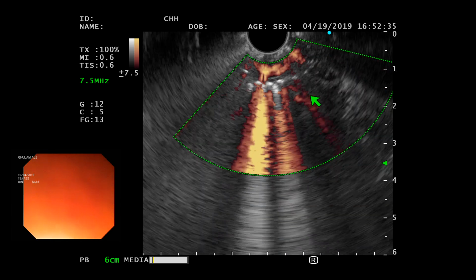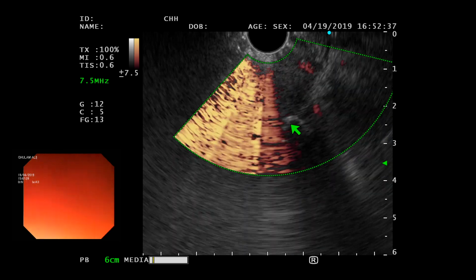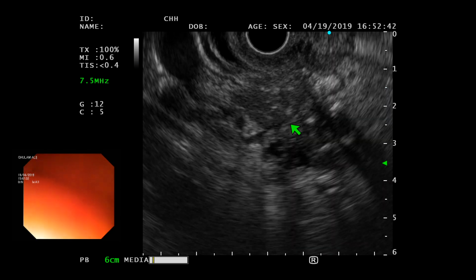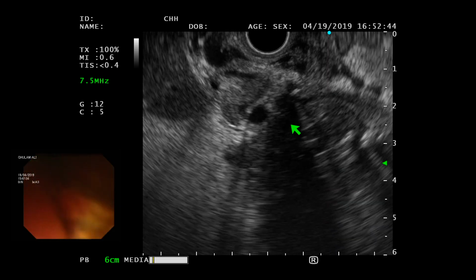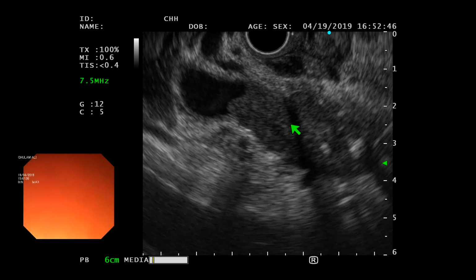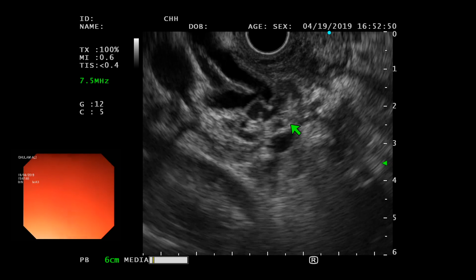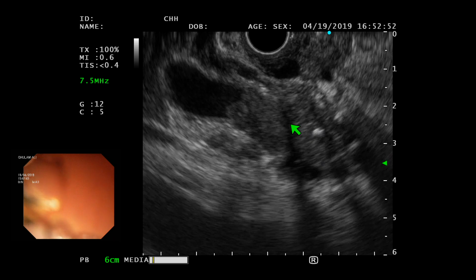तो ये जो सारा है, following, lot of collaterals, और ये जो head का area इधर से आना शुरू हो जाता है, ठीक है? ठीक है, यानी इधर से मैं शुरू करूँ। हाँ, इधर से. If you start from here, when it's laying down on your hand, even further. नहीं, अभी आप क्या देखें ना, आप अब तो मूव कर, अभी इधर से.